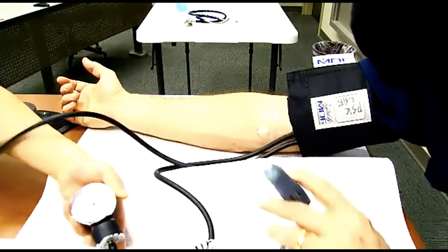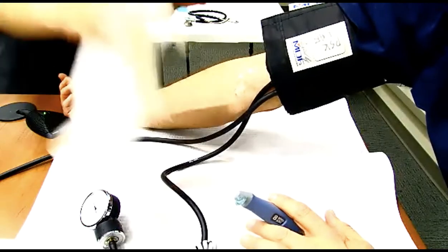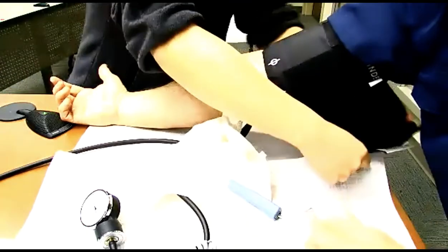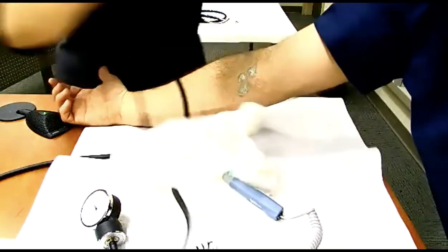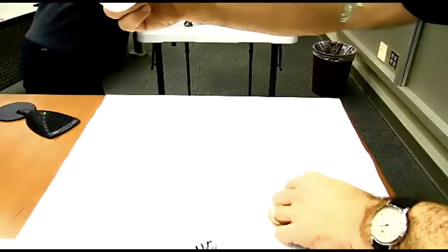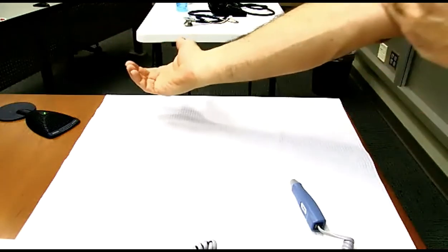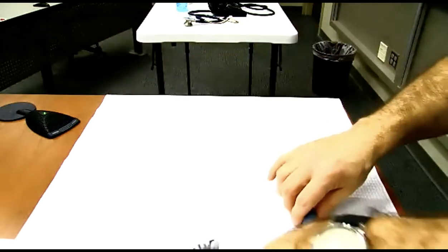So that's the idea, as Judy would have removed the cuff, is that what you're using is called a sphygmomanometer. Sphygmomanometer, because sphygmo means pulse. It's Latin for pulse. So basically, you are measuring the pulse, is what you're listening for, and using that to actually measure the blood pressure. I appreciate your patience. Maybe that was a long way to walk for that idea.